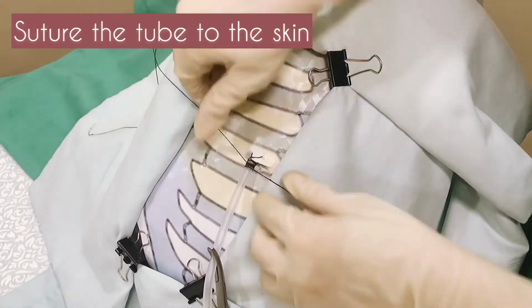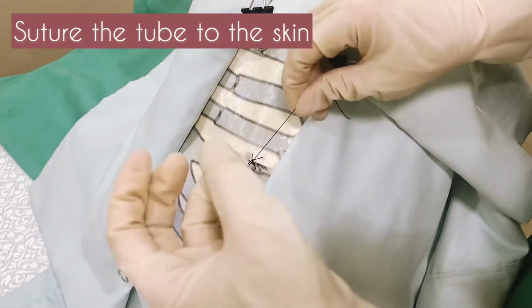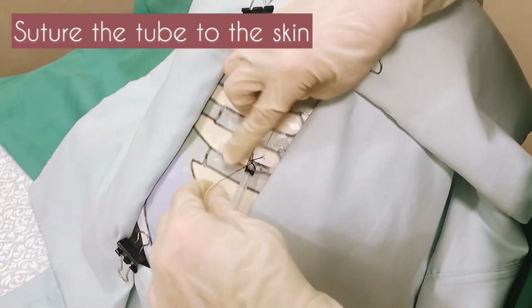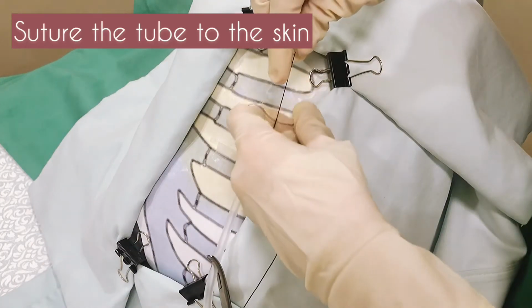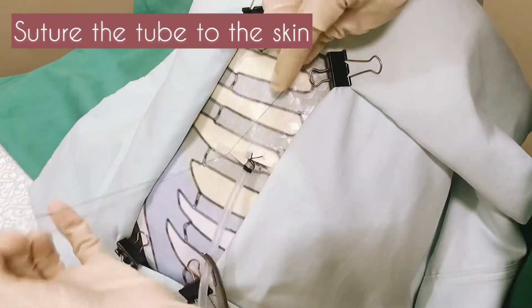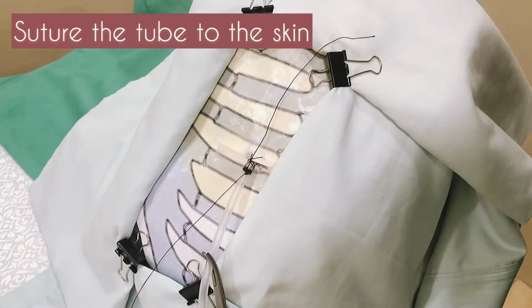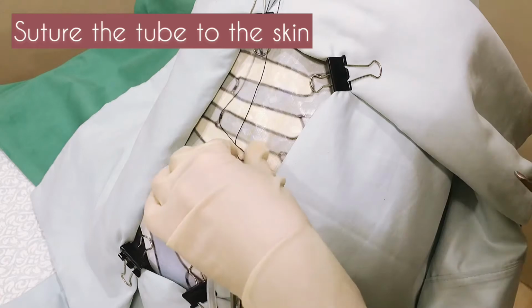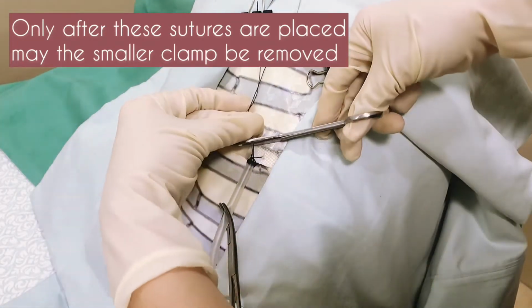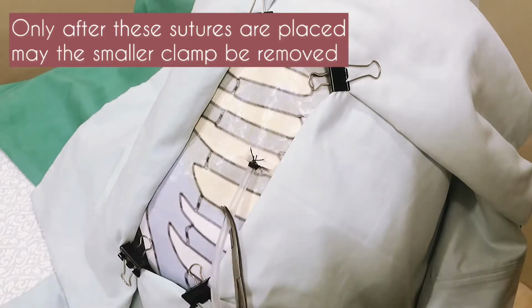Push the suture down to the skin again before tying to prevent slack from being incorporated in the suture. Only after these sutures are placed may the smaller clamp on the tube be removed.